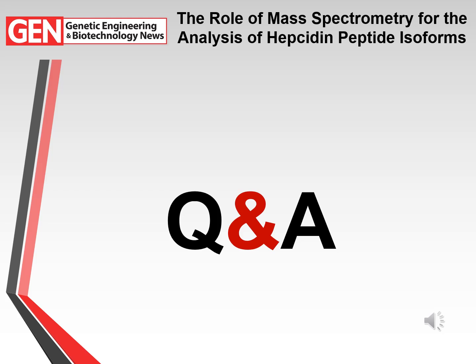Immunoassays, etc., had suffered from different recoveries and some cross-reactivity. However, the very latest immunoassay that's been delivered by Gantz's group, I believe, in California, has resolved a lot of these issues.